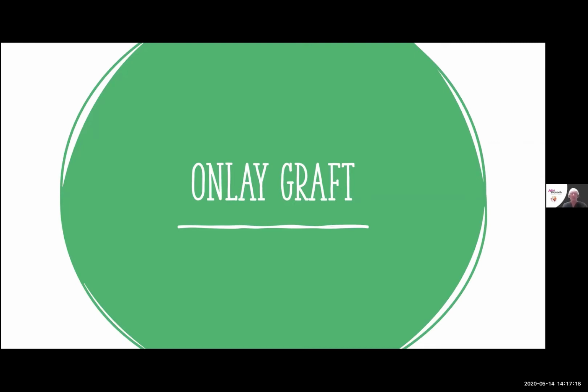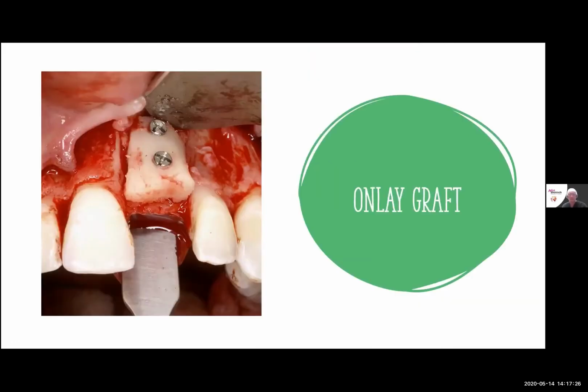He's going to be a little bit behind with everything, but onlay grafting is a process that can be done. I don't do onlay grafting anymore, and I'll show you the technique that has replaced my onlay grafting. But onlay grafting is a successful technique. It has been used frequently and often for a lot of voids and defects. Essentially, you're taking a graft or donor bone and placing it into the recipient bed.